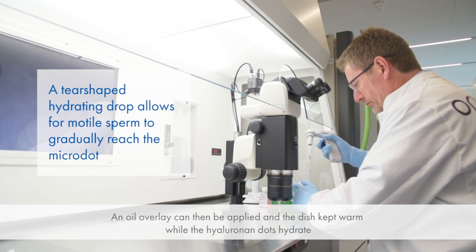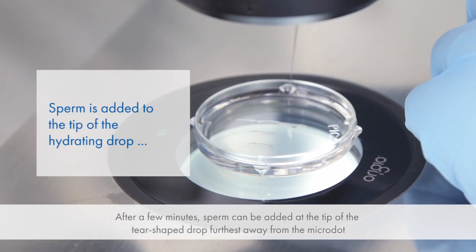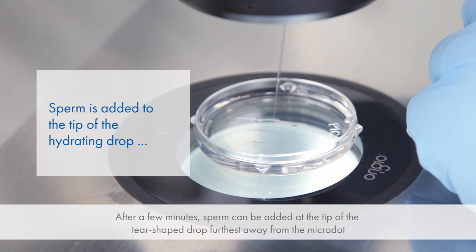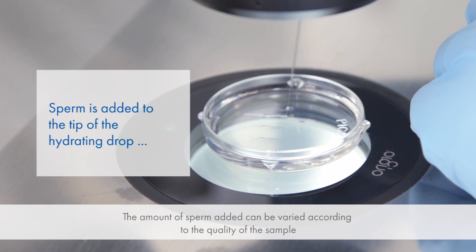An oil overlay can then be applied and the dish kept warm while the hyaluronan dots hydrate. After a few minutes, sperm can be added at the tip of the tear-shaped drop furthest away from the micro dot. The amount of sperm added can be varied according to the quality of the sample.